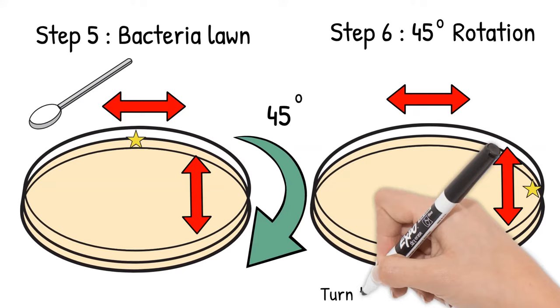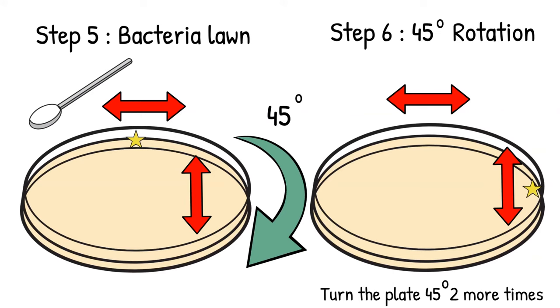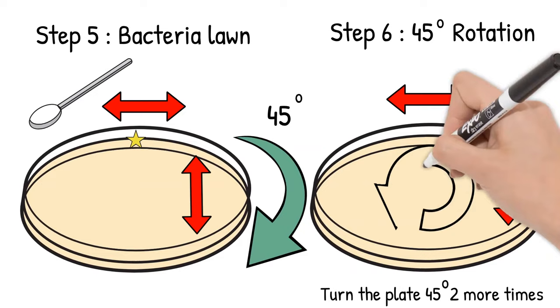Once finished, repeat this step 2 more times to ensure that the bacteria is equally distributed and there is no area that is left out. Do not forget to use the swab to go around the rim of the media.